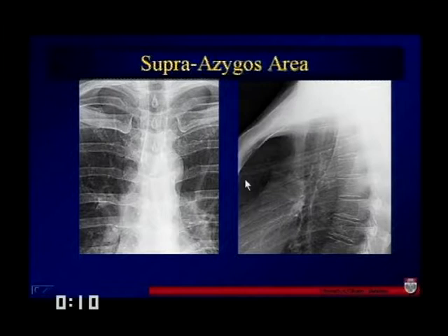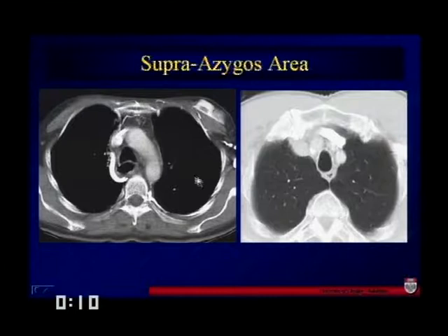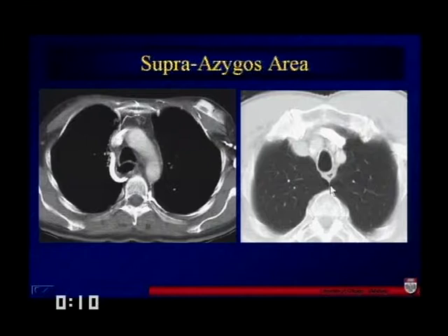In this case we can very easily see the arch of the azygous, well-opacified because of very good infusion. Here is the posterior junction line, well-defined. If we had any kind of posterior mediastinal mass there, it would be difficult to see that on plain radiograph.